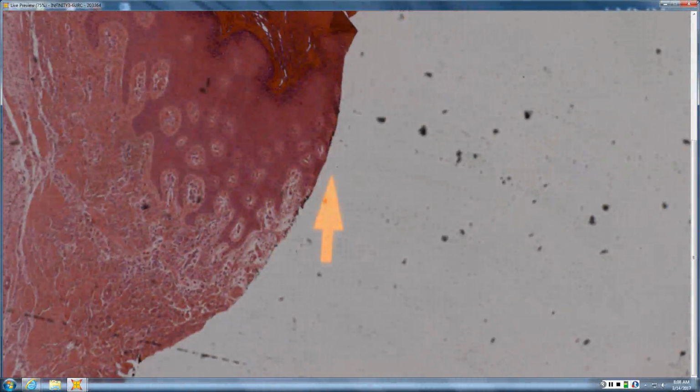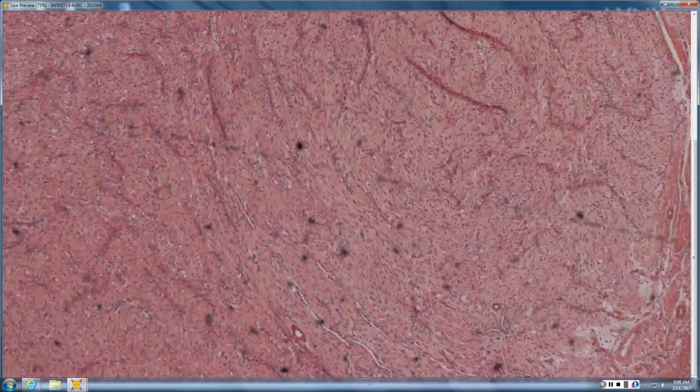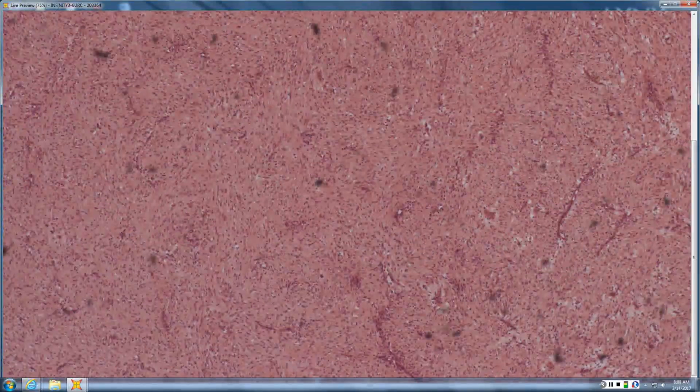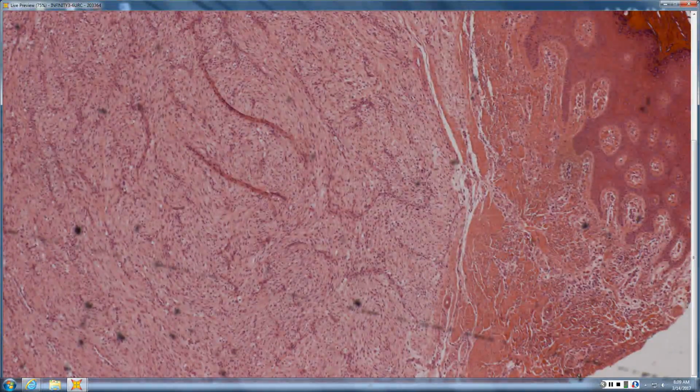So first looking at the edge, where do you think you might be? Acral skin. Something about like the acral fibromyxoma. Yeah, so digital fibromyxoma, acral fibromyxoma, superficial acral fibromyxoma, they're all synonyms. So superficial acral fibromyxoma is a fibromyxoid superficial acral tumor. So what would you call a superficial acral fibromyxoid tumor? Someone decided to call it a superficial acral fibromyxoma, right? Which is just very descriptive of what it looks like.